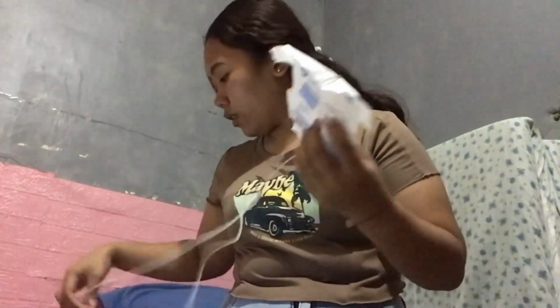So you have to gather all the supplies before you proceed to the insertion. So first we have here sterile gloves, the catheterization kit. So we also have here, this is the urinary bag with a catheter. So just imagine this is the catheter and this is the urinary bag. And then this, just imagine this is a lubricant.